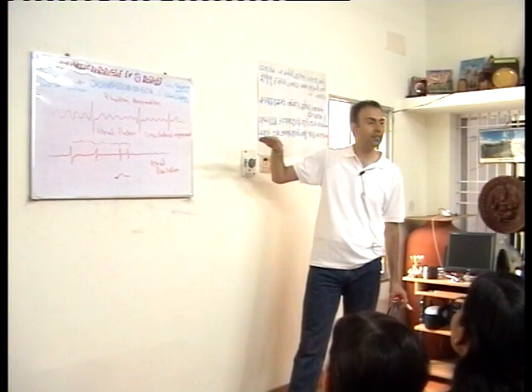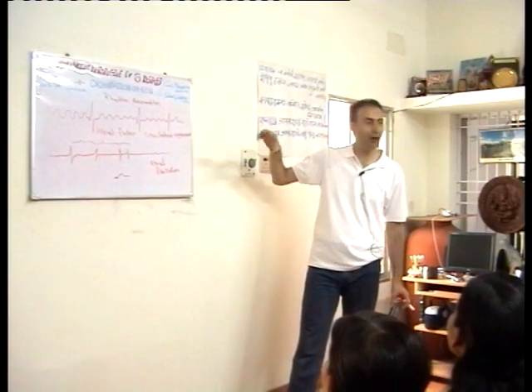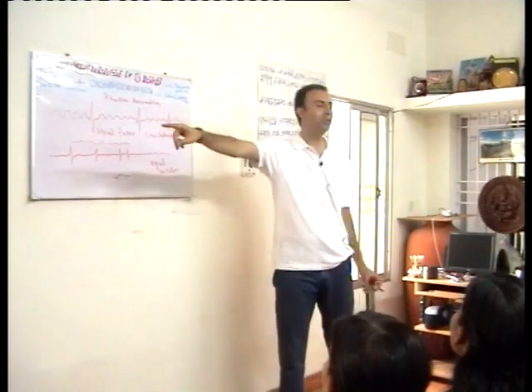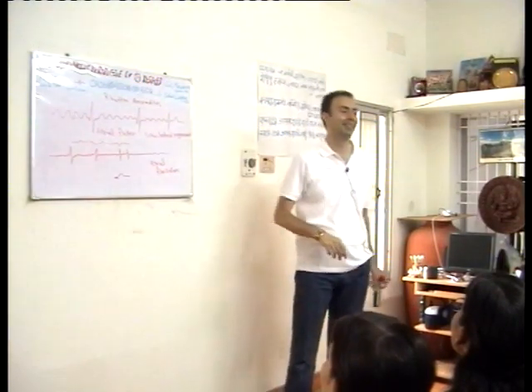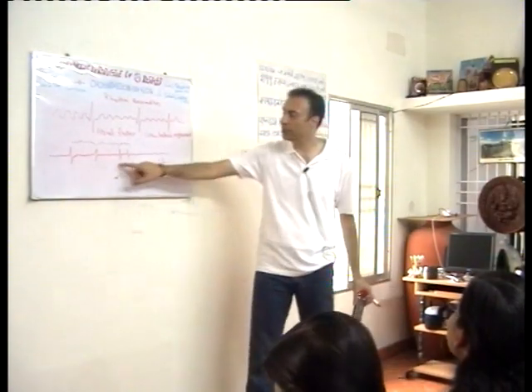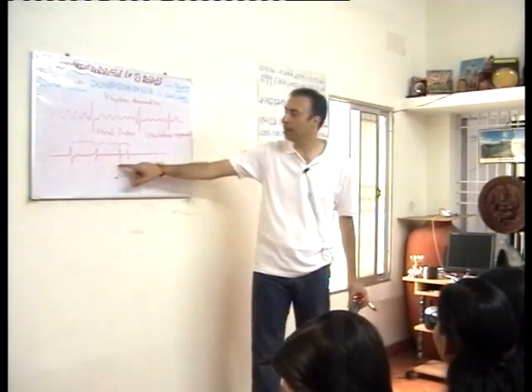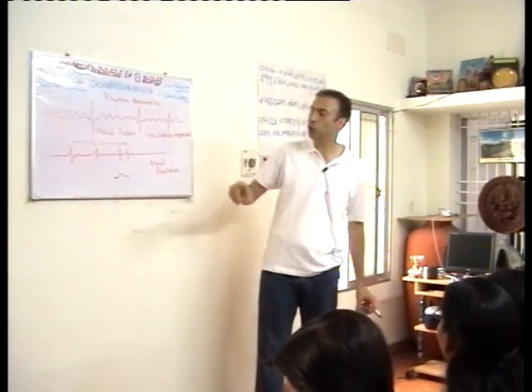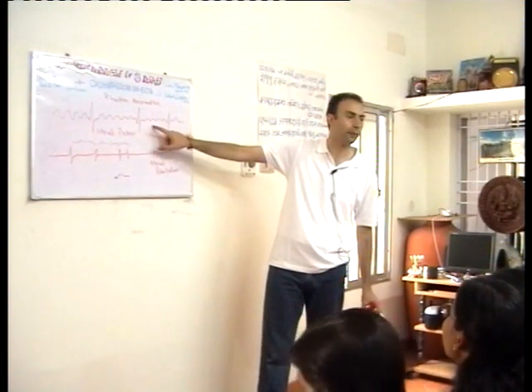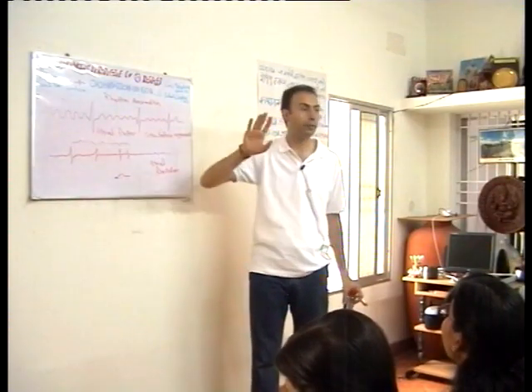Stasis of blood leads to clot formation. So whenever you pump it, after some time, the clot will go into the systemic circulation. It can be dangerous, okay? But still the ventricle is working properly, more or less. Ventricular action is there. Usually this is less dangerous than this one. I told you, whenever you see sawtooth, you be careful.